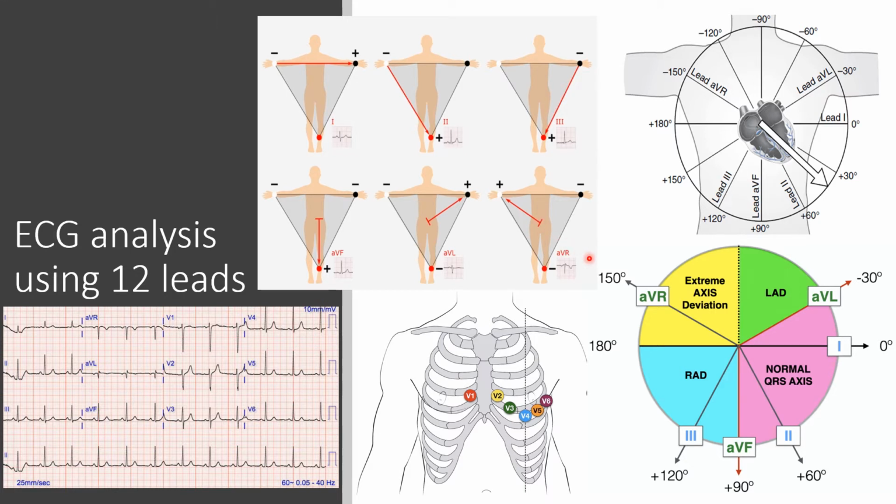As you can see, each lead is going to help you detect the electrical activity of your heart from different angles. Basically from 12 different angles, because you also put 6 right here on the chest. So if we say that here is the heart right there, you're basically getting information from all of these different angles. Okay, so guys, this is lead number 1.